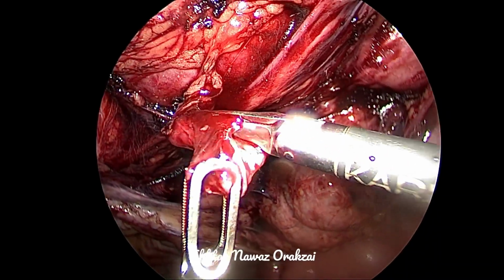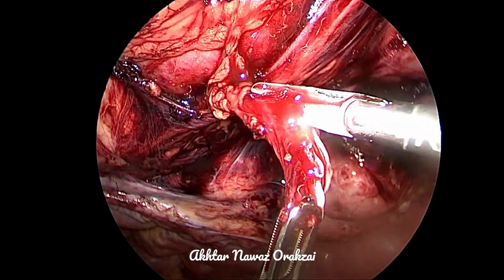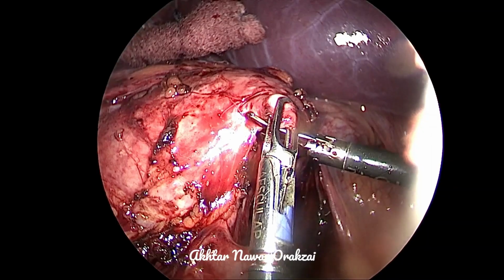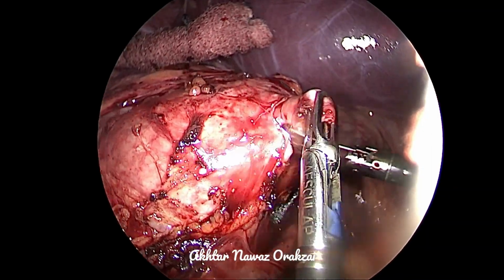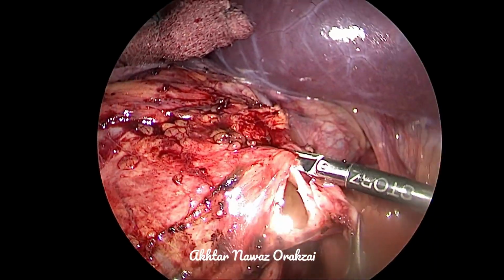And then we spatulate the ureter. Remember, the spatulation should be at least 2 to 2.5 centimeters. And then we excise the part of the pelvis and the PUJ which is obstructing.